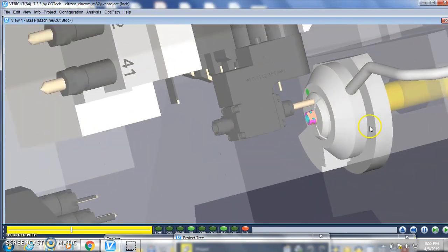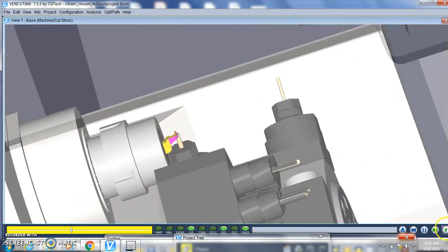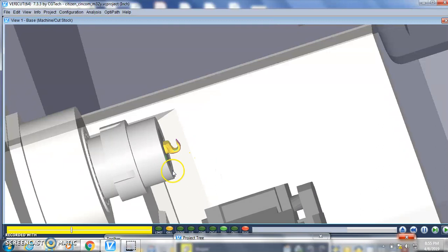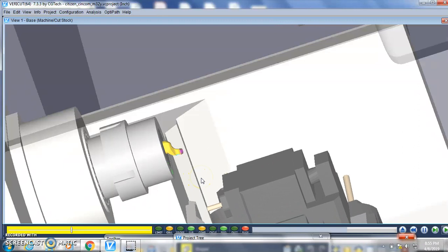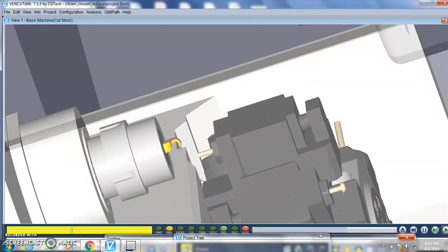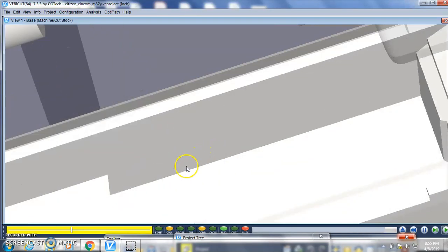So if you look at the back-end work at the same time, now the lower turret is coming back and working on the sub-spindle. You can see that the red is flashing. That means the holder is rubbing on the sub-spindle collet. So we need to either stick the tool out a little bit longer, giving a longer overhang, or we may have to use a different type of collet nut, one with a nice smaller profile.